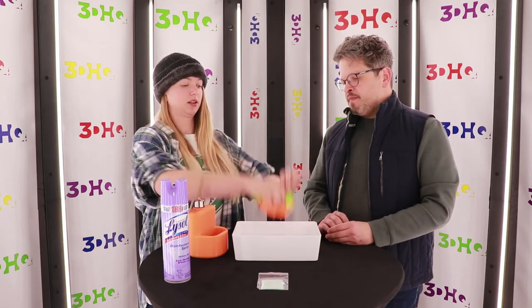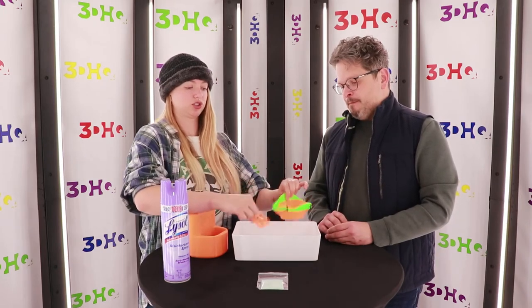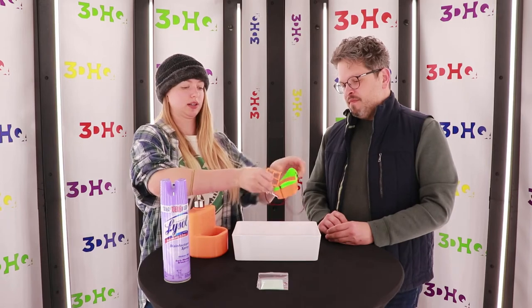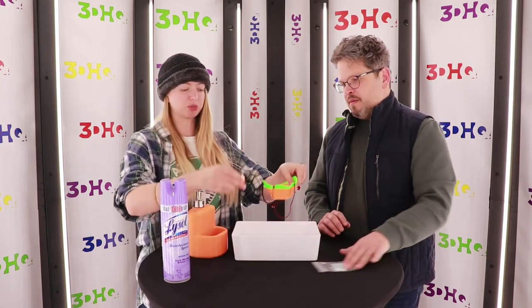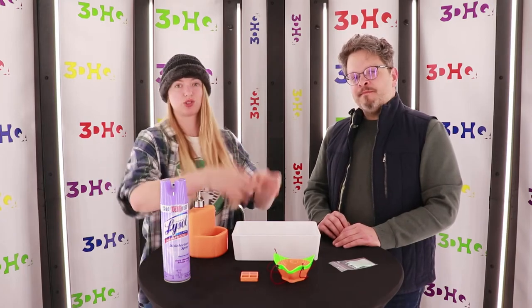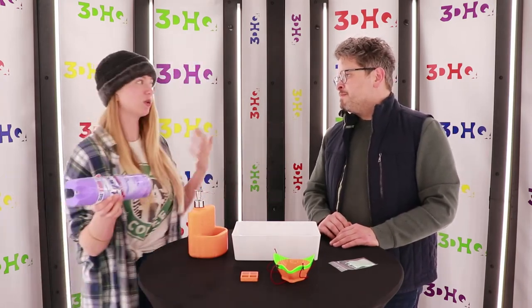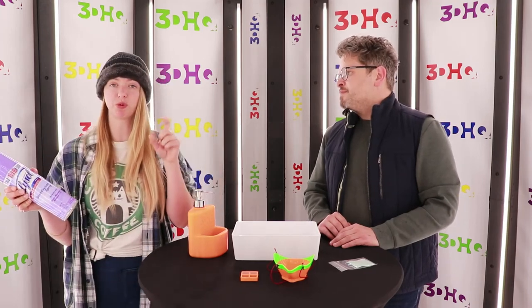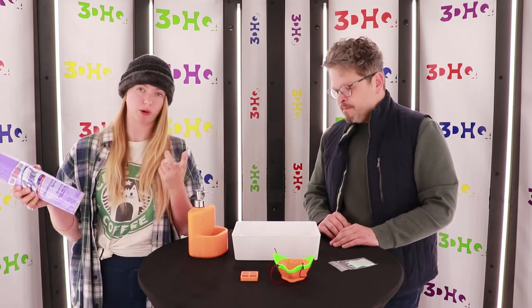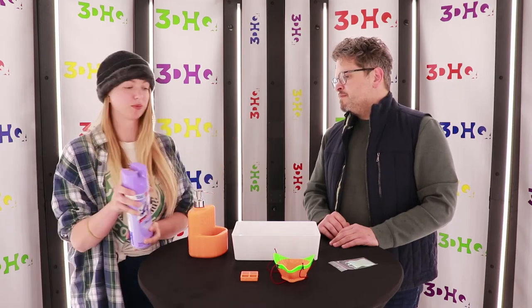Then you're going to take your mask and your frame out and spray them with a disinfectant for an extra layer of protection. We have Lysol, which has some scents in it. You can also use a spritz of rubbing alcohol or hydrogen peroxide — anything to just give it that extra layer of protection.